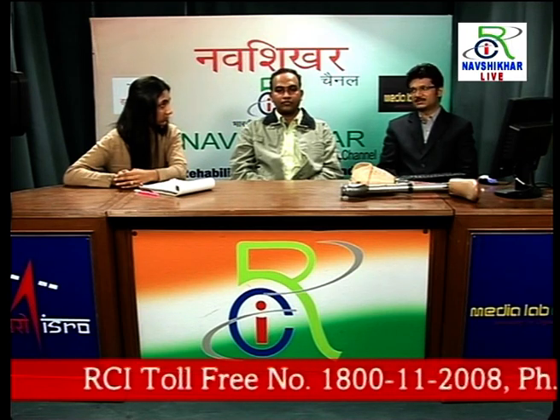The child grows very rapidly, and in such a case, if you are going through an integrated system, then in this type of system we have to frequently change the whole prosthesis. But in a modular system, only the socket is changed, and sometimes, at 2 to 3 years duration, the foot unit is changed. The whole system, like the pylon, the ankle adapter, the socket adapter, and the costlier joints, does not need to be changed. This is the basic benefit of the modular concept.